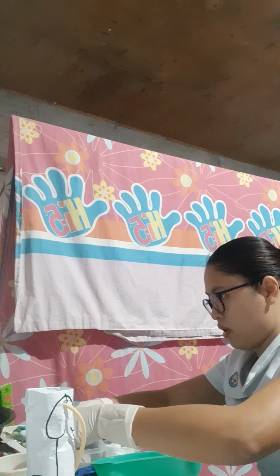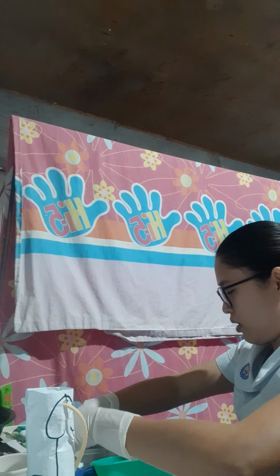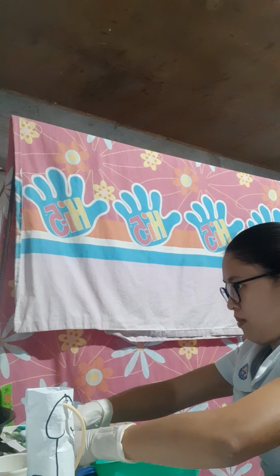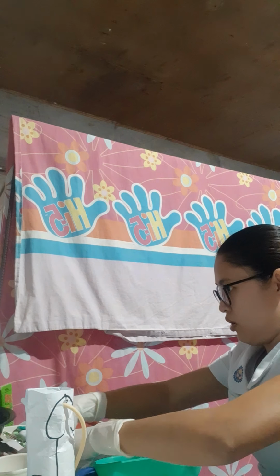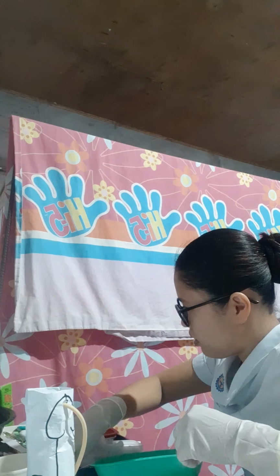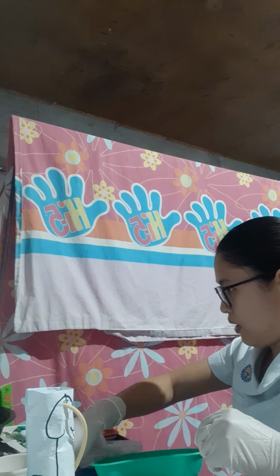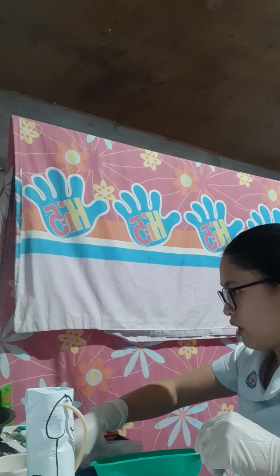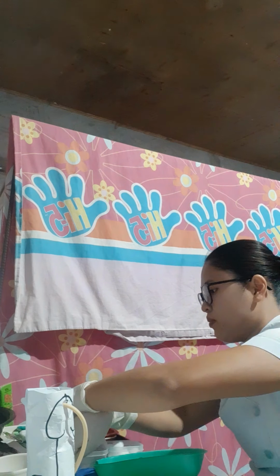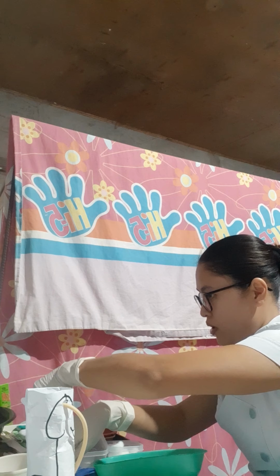This allows slack in the catheter, so movement of the thigh does not create tension on the catheter. Then be sure there are no obstructions or kinks in the tubing. Place the excess coil of tubing on the bed and fasten it to the bottom sheet with a clip on the drainage set or with a rubber band or safety pin.